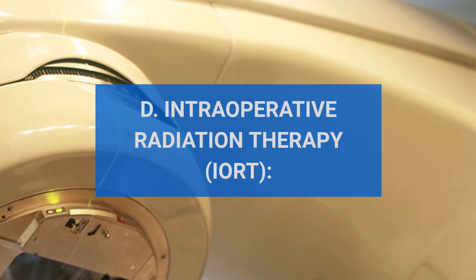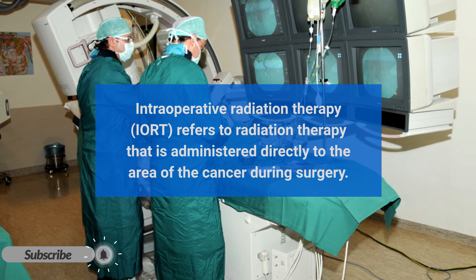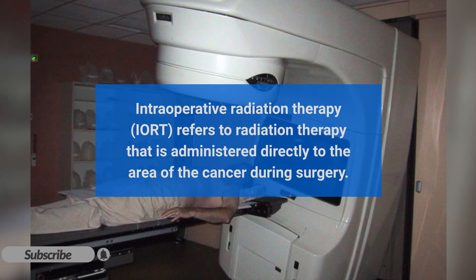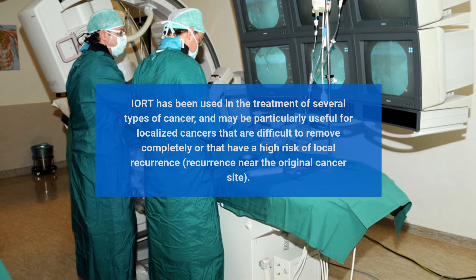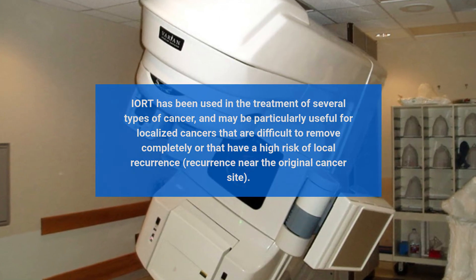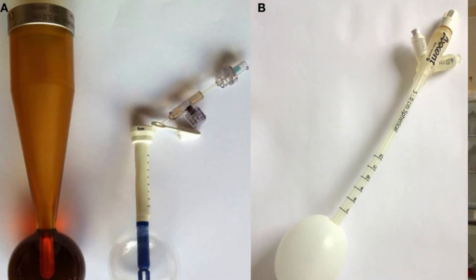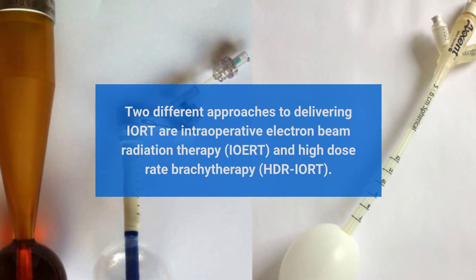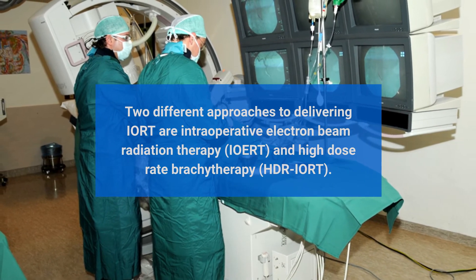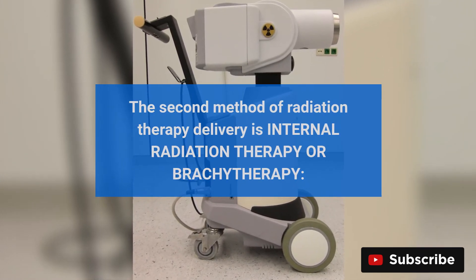Intraoperative Radiation Therapy (IORT): IORT refers to radiation therapy that is administered directly to the area of the cancer during surgery. IORT has been used in the treatment of several types of cancer and may be particularly useful for localized cancers that are difficult to remove completely or that have a high risk of local recurrence — recurrence near the original cancer site. Two different approaches to delivering IORT are Intraoperative Electron Beam Radiation Therapy and High Dose Rate Brachytherapy (HDR IORT).